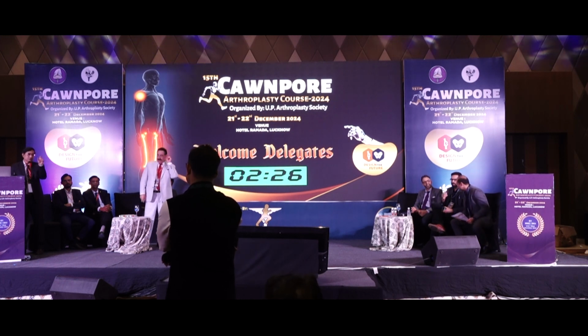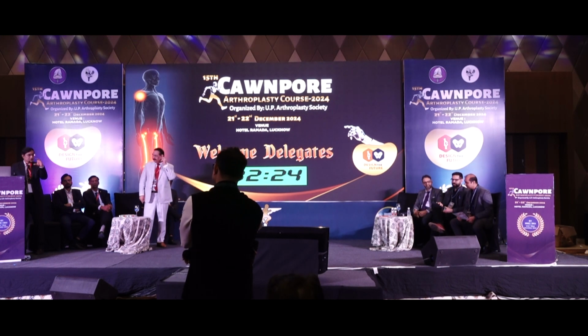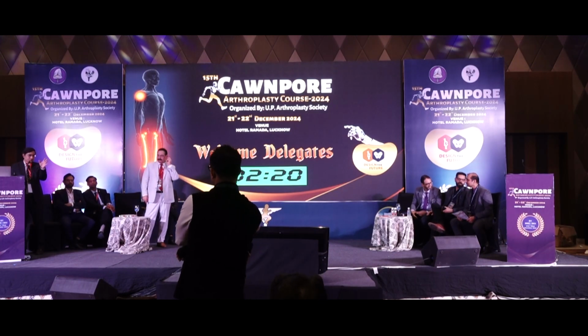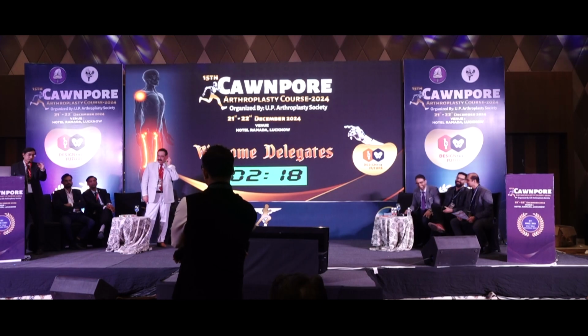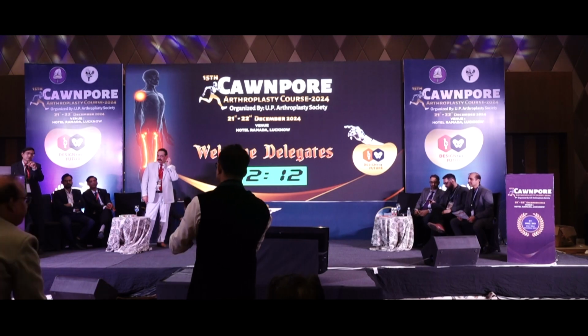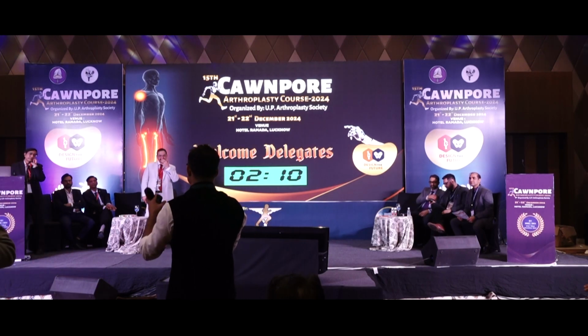The other way is when there is a big defect, but the cup has a reasonable amount of anterior posterior stability, but there is a defect there, and you don't want to leave it there. In that case you put the augment later on, as I showed you. So in the trial you will be feeling for it after you.